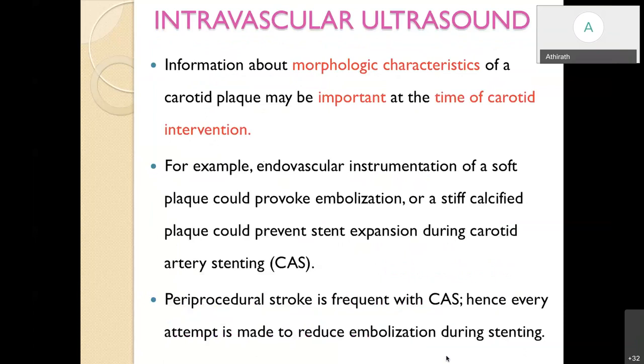Next topic is intravascular ultrasound. This is actually an invasive technique and not a non-invasive technique. What is the basic advantage of intravascular ultrasound? I'll tell you later. Before that, we need to know about the morphologic characteristics of a carotid plaque, which are important at the time of planning a carotid intervention.